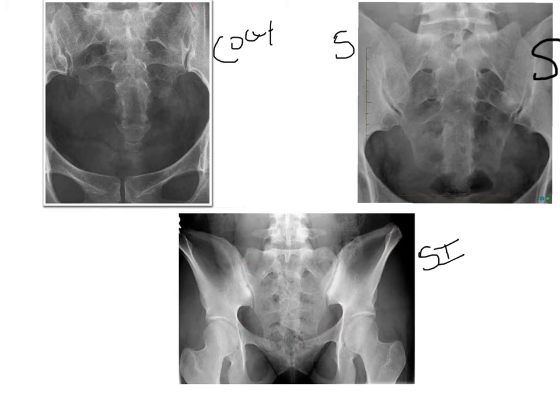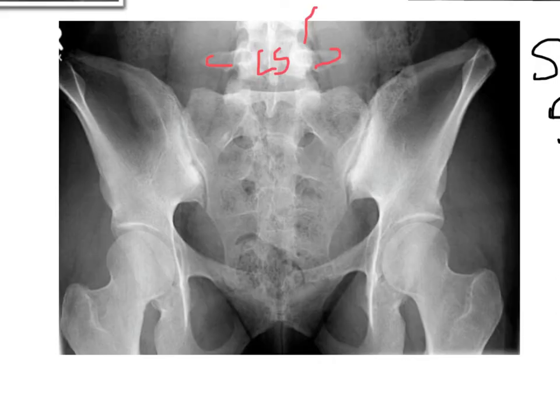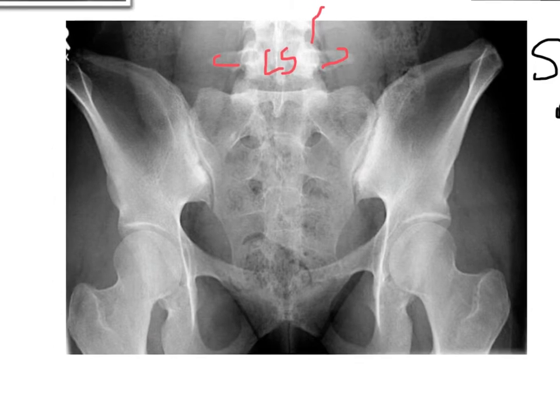Okay, and a quick look at anatomy. We are looking at L5 here. Of course, the transverse processes of L5. I'm going to zoom in just a little bit if I can, so give me a second. Okay, here we go. L5 is transverse processes of L5. You have spinous processes, L4 and L5. You have the L5-S1 intervertebral disc space, pedicles of L5, and vertebral body.